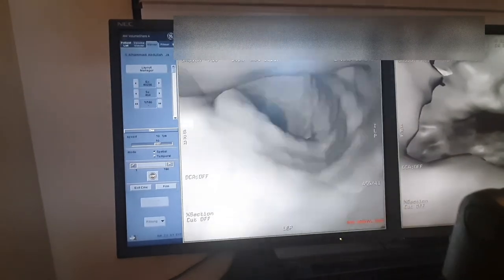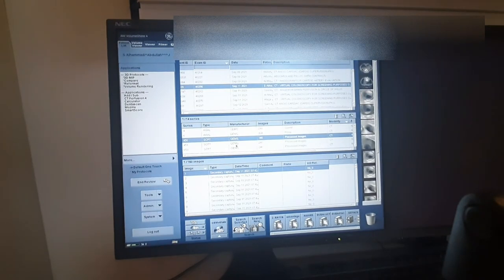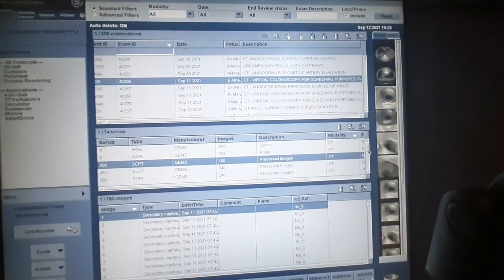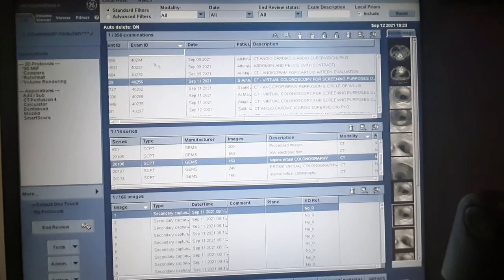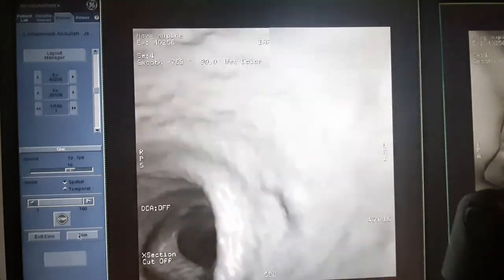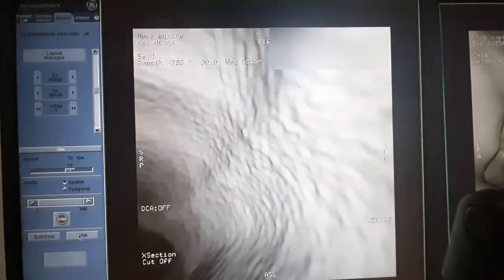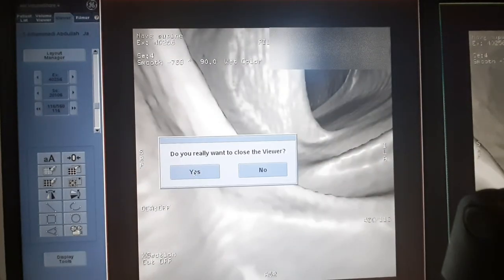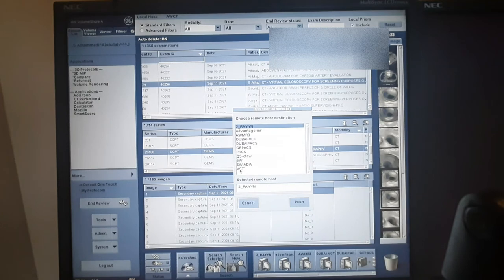Then exit: click exit sign cine, then exit. That's it, you're done. Check what we did. If you want to open and view — that's it, we're done. If you want to play, here it is. This is the one you will send to the PACS system. Exit, then send to VCT or GPACS and push — we're done.